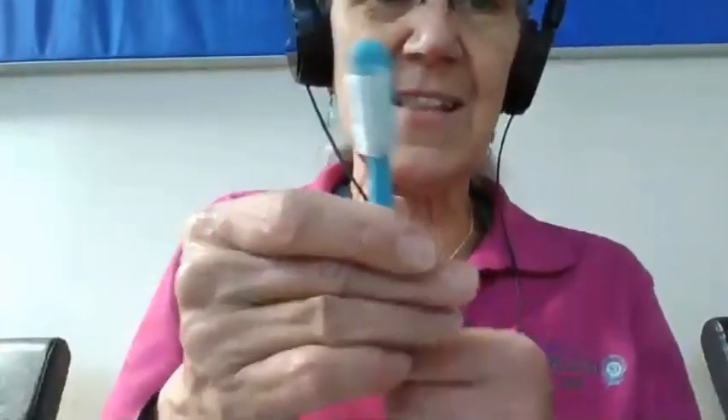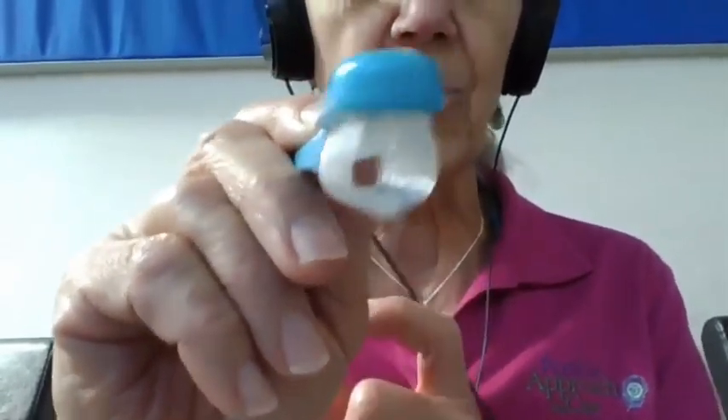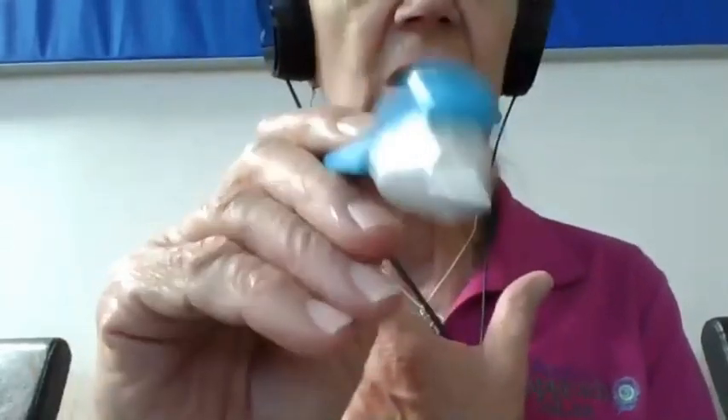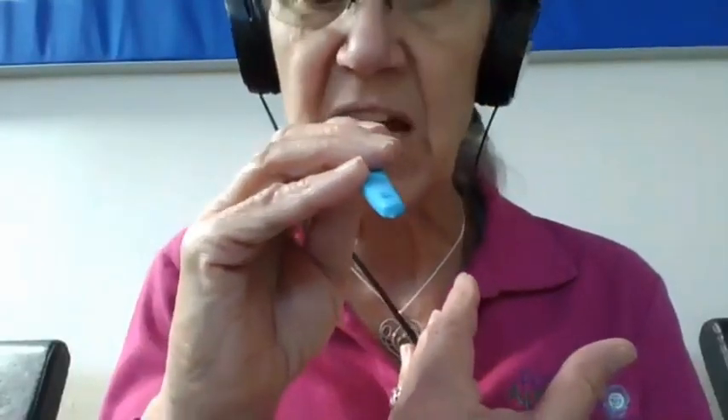The term for it is the Collis Curve toothbrush — Collis Curve. It comes in a variety of types: medium, soft, periodontal, baby, and junior, because it was originally designed for children and young adults with developmental disabilities. But I actually think this might be something that could really make a difference in reducing gingivitis for many of our folks in the ruby, amber, and even the pearl stages.